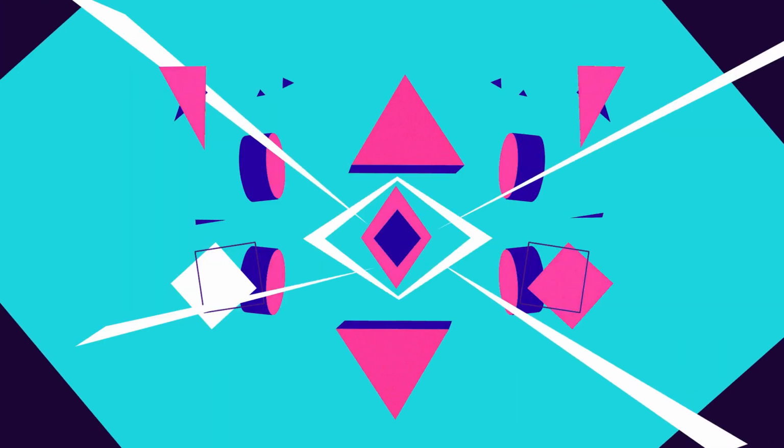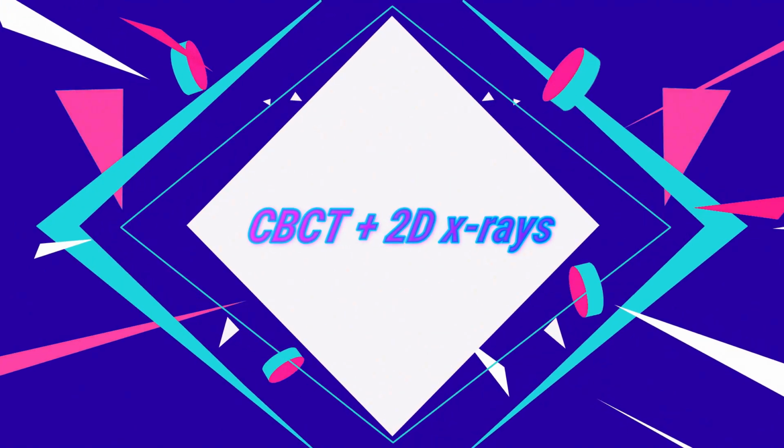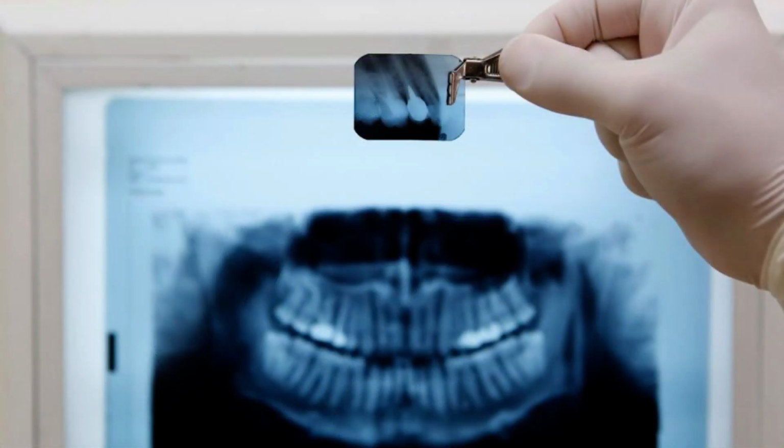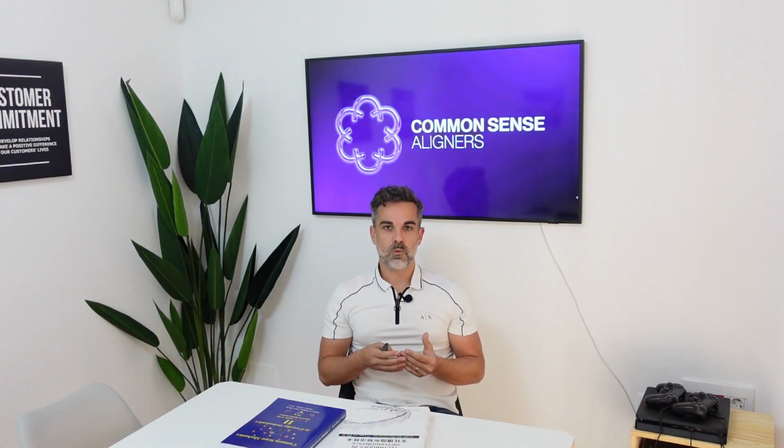The next piece of hardware we're going to think about for our dental office are the machines we're using for x-rays. These are really important. And up to 10 years ago, we were all using 2D, two-dimension x-rays, lateral or panoramic x-rays. But today, there are a couple of things that have improved a lot. First of all, the cost of 3D technology is much cheaper than it was. And also, the radiation dose is much lower.